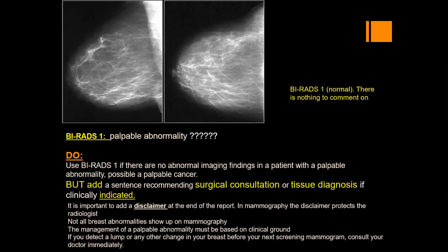Some recommendations say it's important to add a disclaimer at the end of the report that can protect the radiologist, like: not all breast abnormalities show up on mammography. The management of a palpable abnormality must be based on clinical grounds. And if you detect a lump or any other change in your breast before your next screening mammogram, consult your doctor immediately.